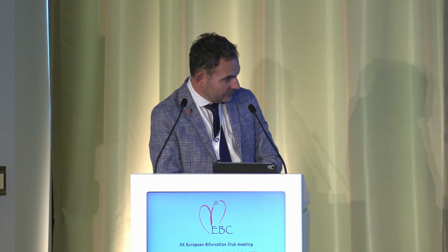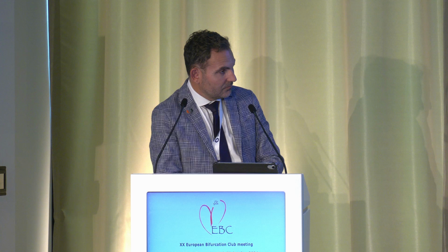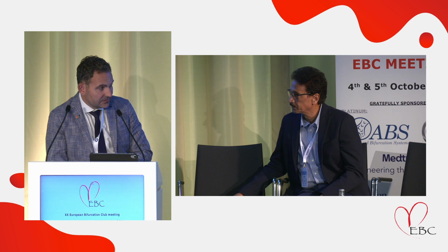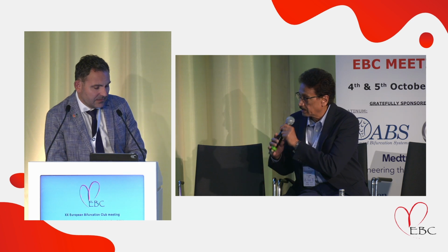So, wonderful talk. My question is that in bifurcation, when you're doing the wiring for the side branches, you usually like to go with the OCT as compared to the IVUS. Do you by any chance recommend that we use both these techniques, the IVUS and the OCT, to come to the final conclusion as far as the bifurcation stenting is concerned? The question is whether we can use IVUS instead of OCT. Is that the question, if I understand this well? Yeah. Because we would like to have the OCT better to designate.